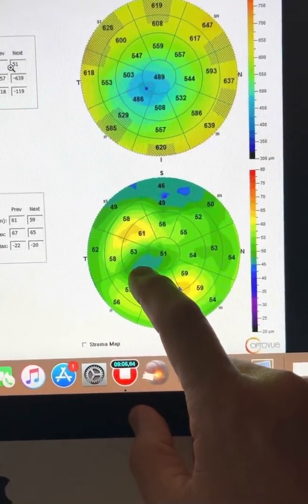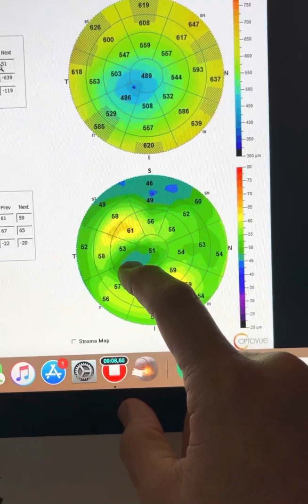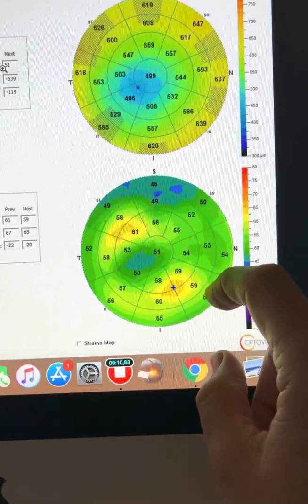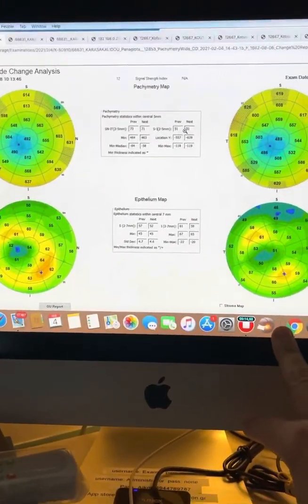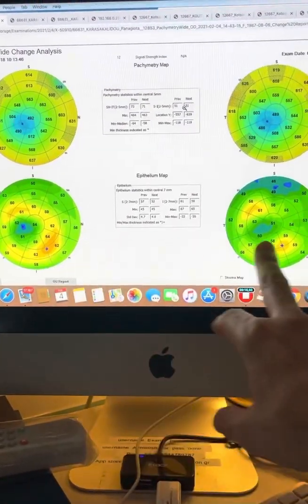We don't see any dark blue at the peak of the cone. We see that the remodeling epithelium around the cone has really stepped back. Let's go back and look at this a little bit more as an overview.